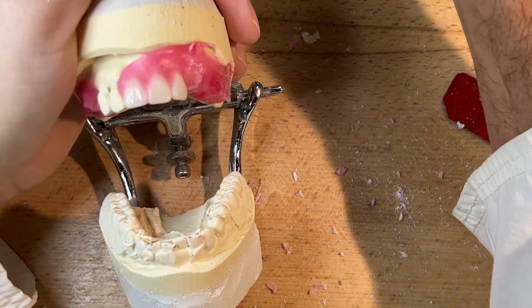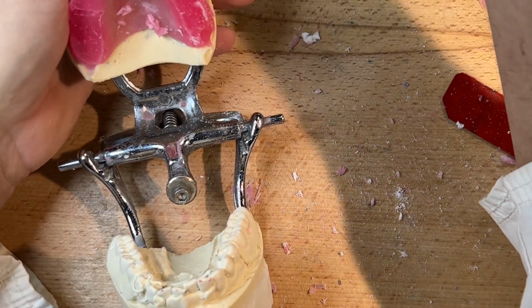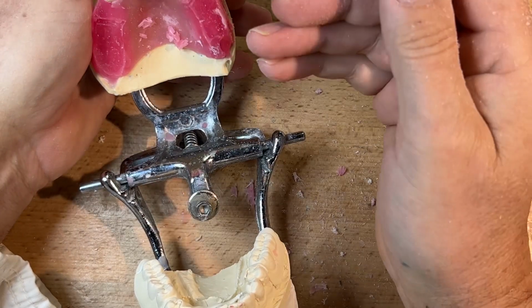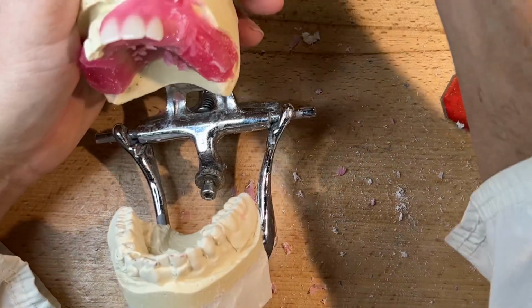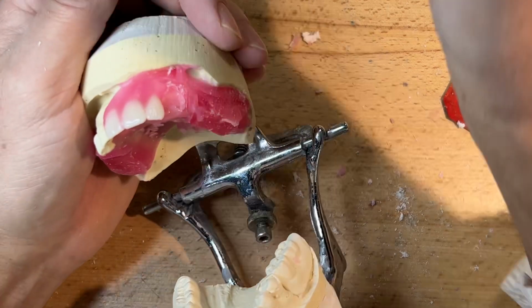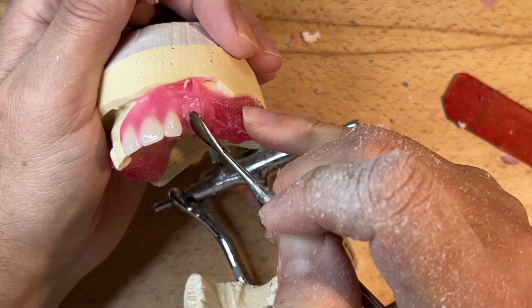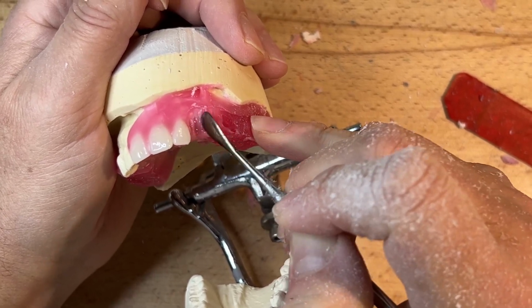Now, probably a decent impression, but probably border mold on the reline. And for the interim denture till we have the soft liner, I think I'm a pretty good estimator. My alginate was done very well.